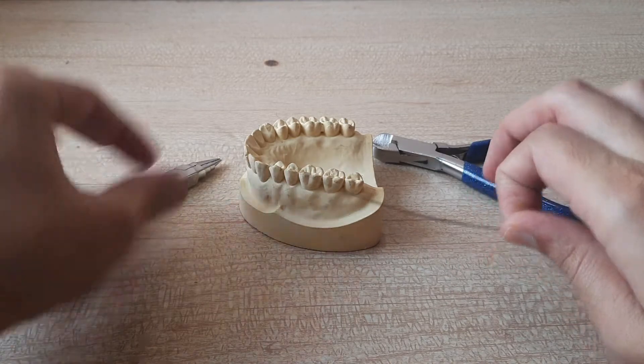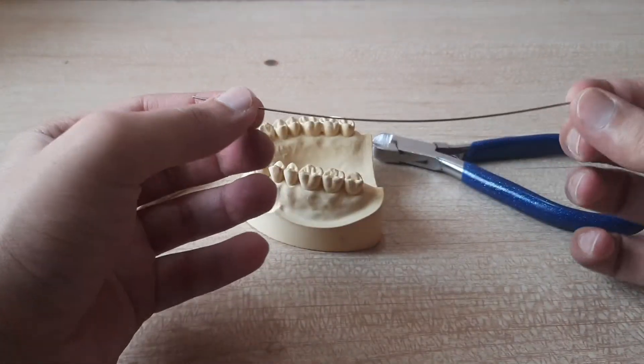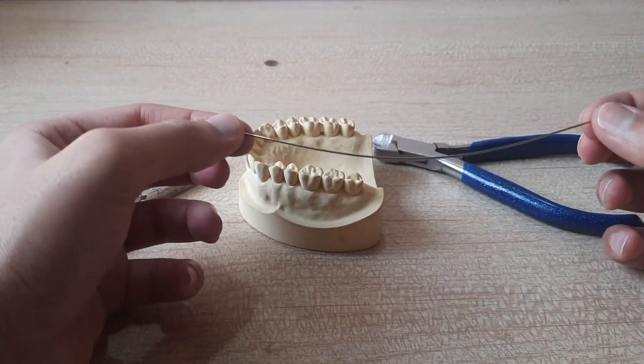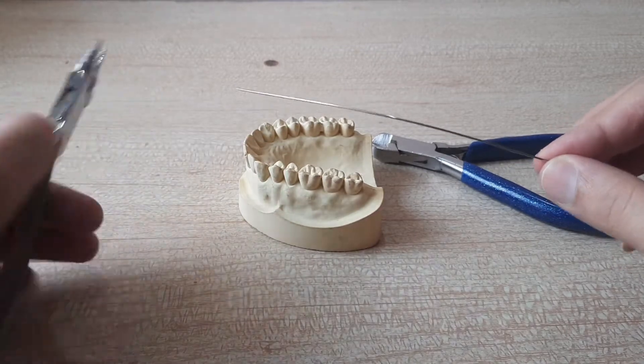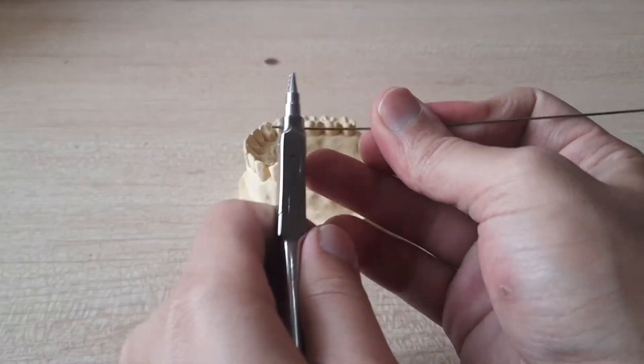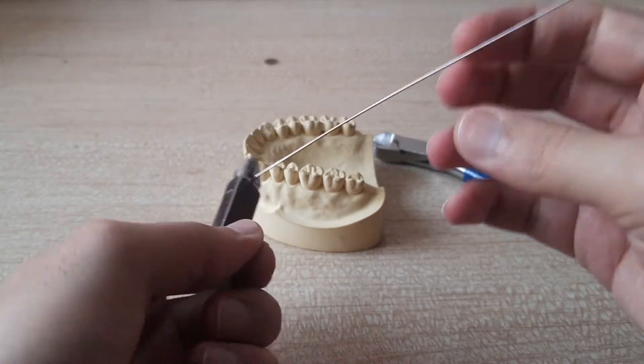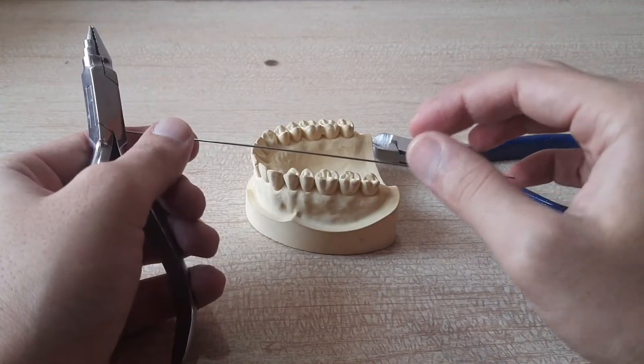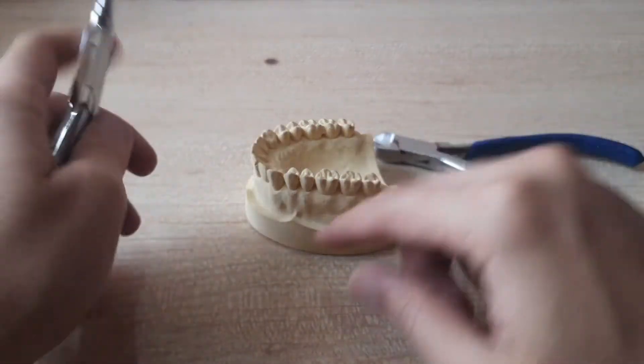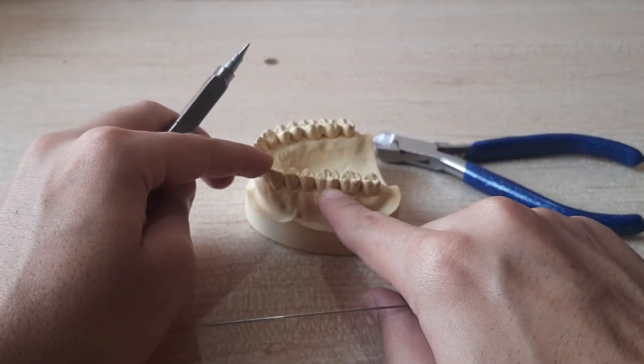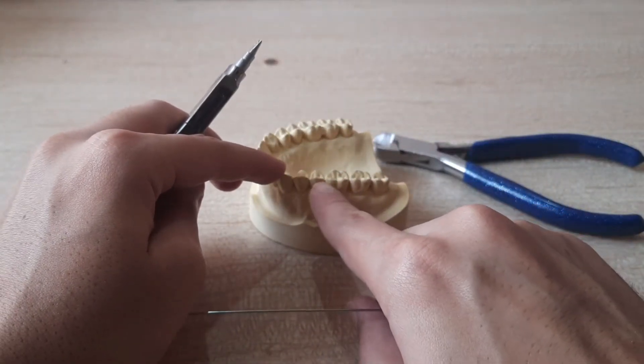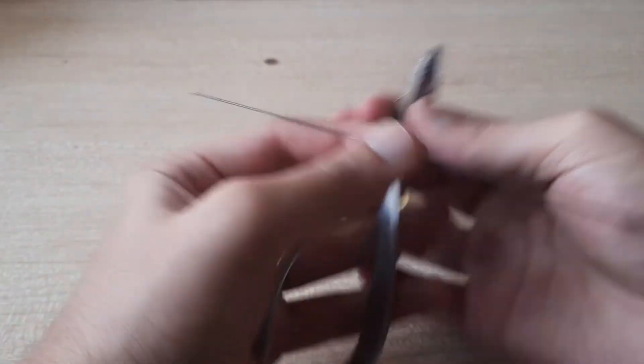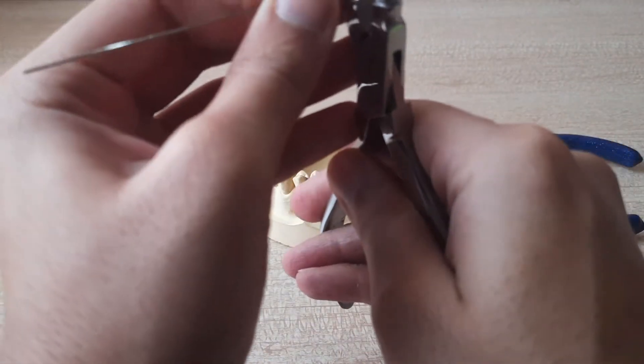So first of all you take the wire and I've already cut it into the size which I want. You just have to straighten it a little because a little bit of straightness is required, not completely but yeah this much is fine.